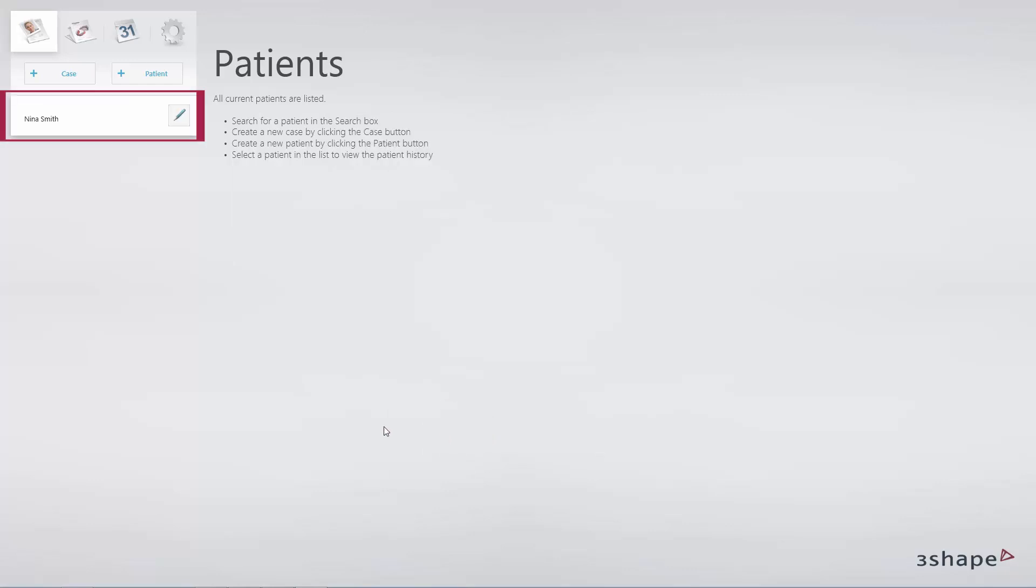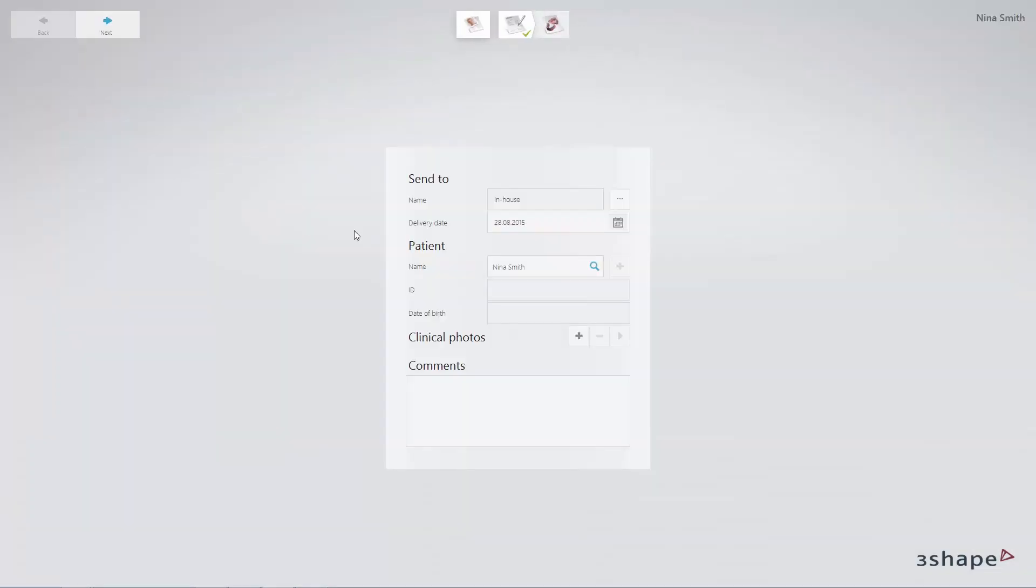The patient list will appear in the upper left corner. Click Case to create a case for the selected patient. Fill out the required fields and click OK.